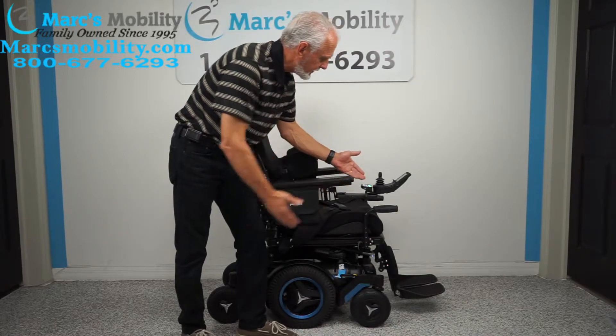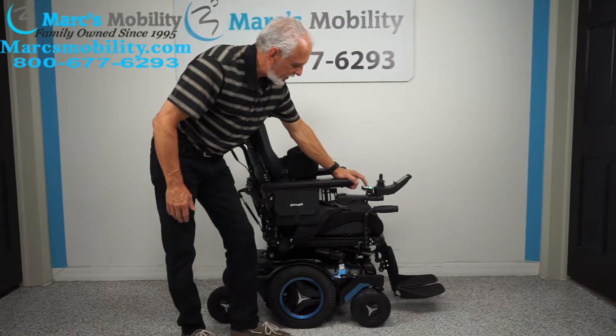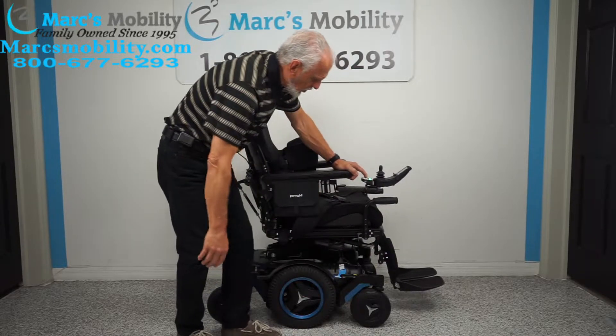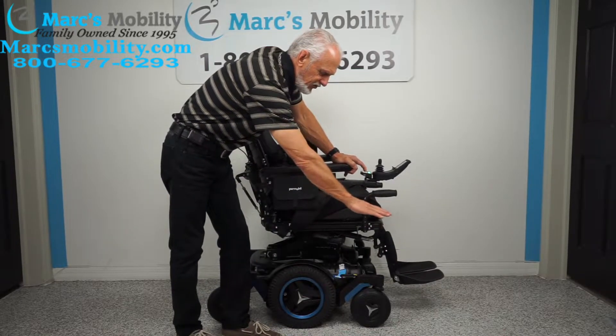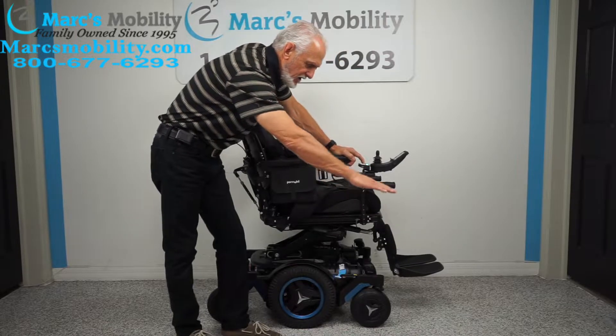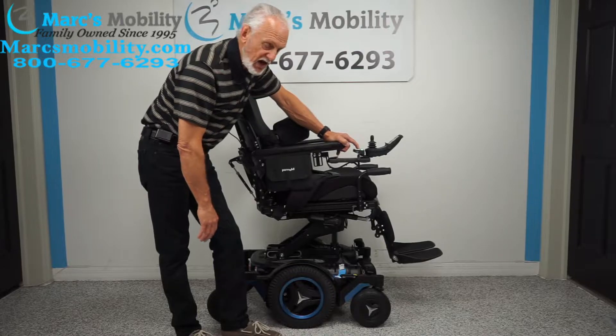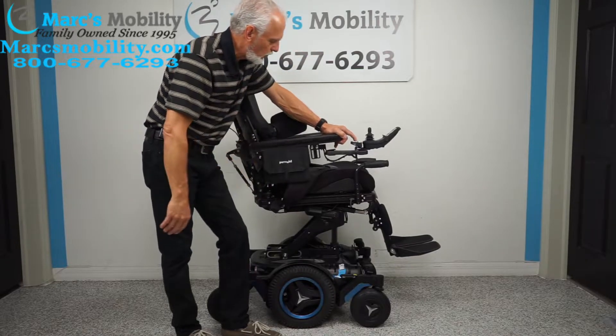I like to use the switch box — it's quicker. The first button on the switch box is your seat lift. As you can see, the seat is starting to go up. You'll start at roughly 22 inches, and if you add 14 inches you'll be a total of 36 inches high — definitely eye level with someone standing.